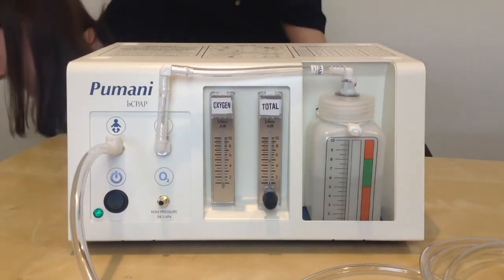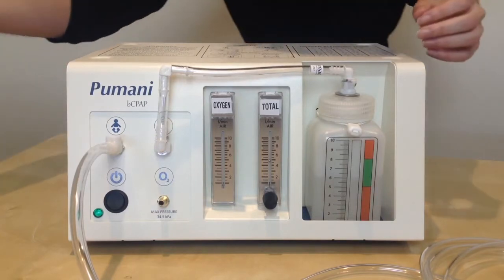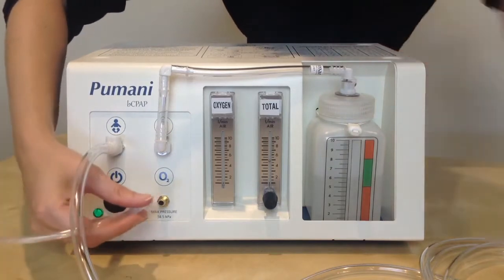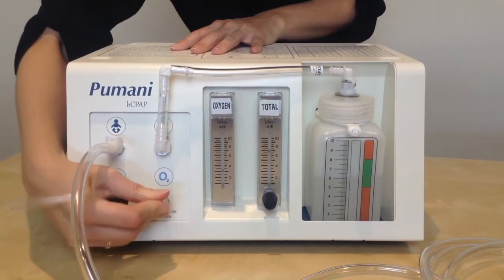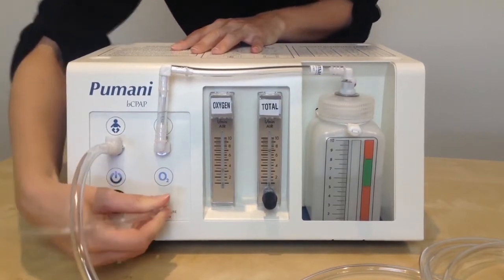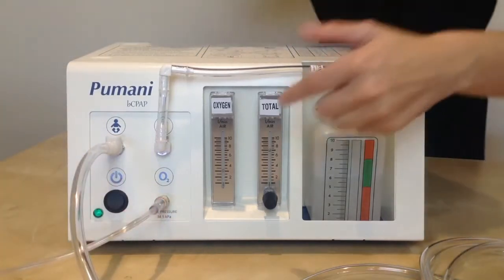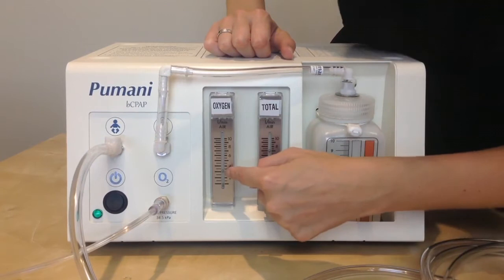So I will take my oxygen tubing from the concentrator. I've set my concentrator to 3 liters per minute. I will connect it here at the oxygen port. Make sure it is firmly on the oxygen port. And then you will confirm that the oxygen flow is 3 liters here.